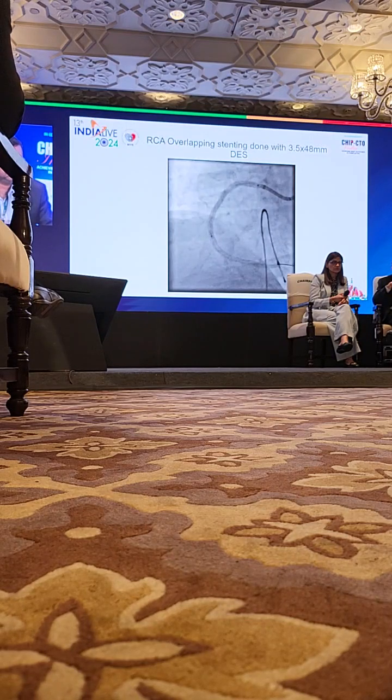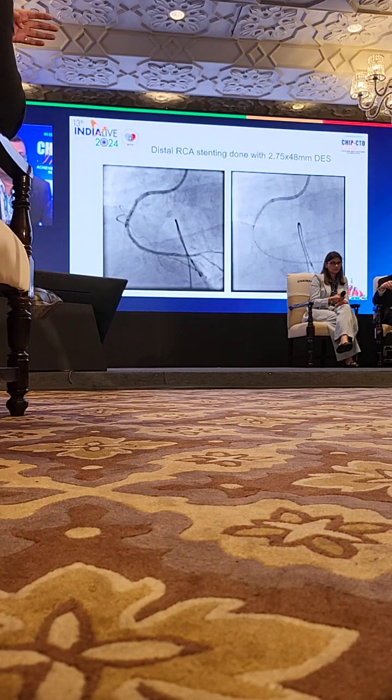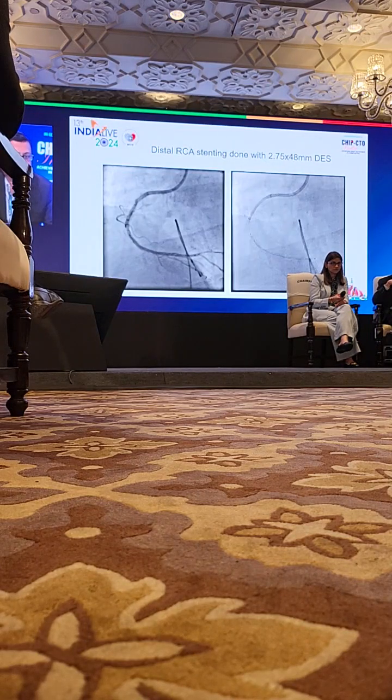And the second thing that could have caused the slow flow is that your guideliner had gone very deep. At times when you have a large RCA and the guideliner goes deep, the anatomy of the vessel changes. So if there is delay, it can cause some slow flow. That was expected because your guideliner had gone up to the mid RCA. I agree with sir that your guide was very deep while you were inflating the proximal, so that time was enough to make the gradient. And once the slow flow occurred, the only good thing you did was put in the microcatheter and do the vessel dilation. That was a very good thing.